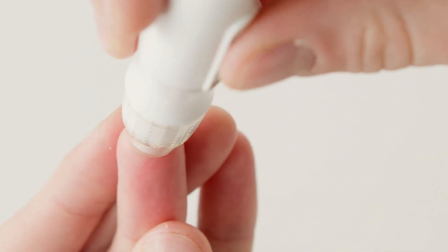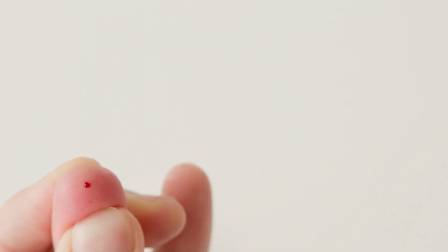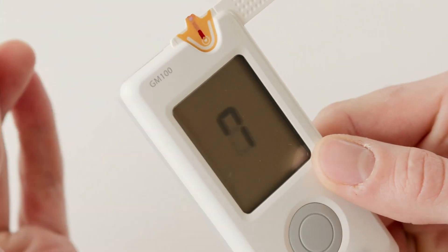Currently, people with diabetes must prick their fingers to extract and test their blood several times a day using glucometers.